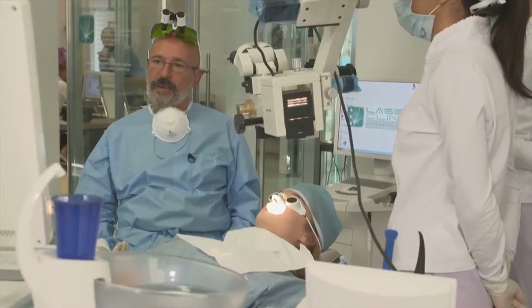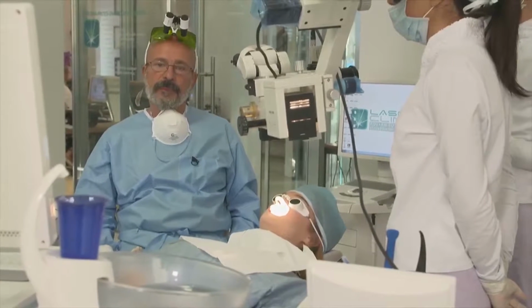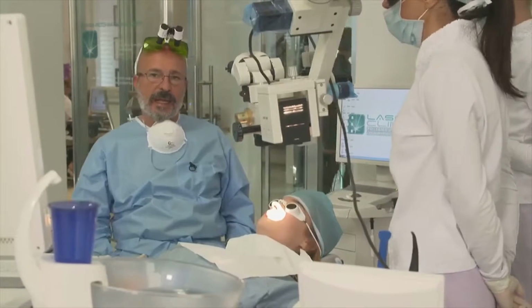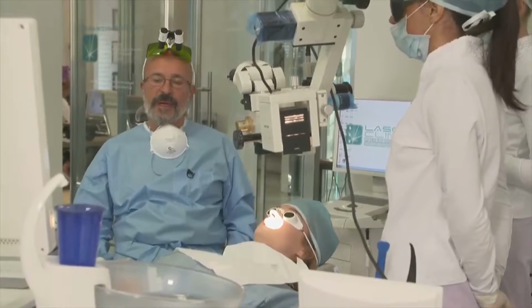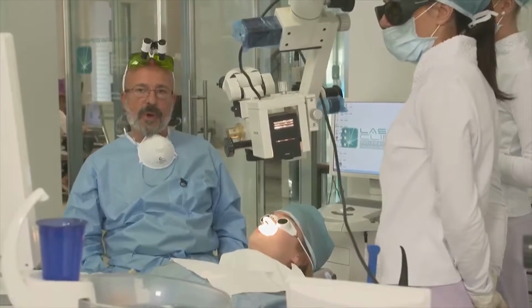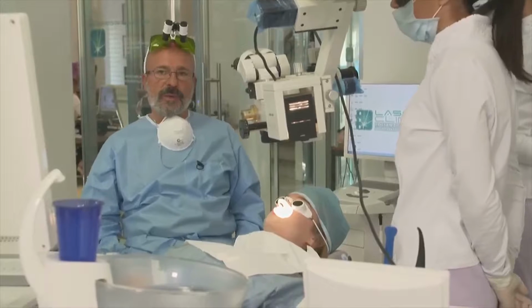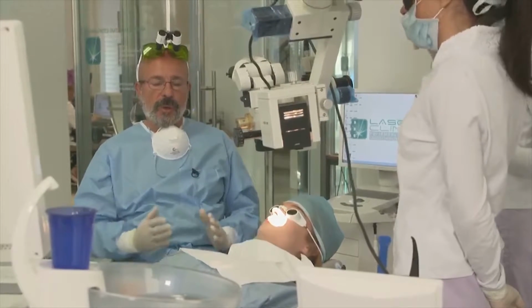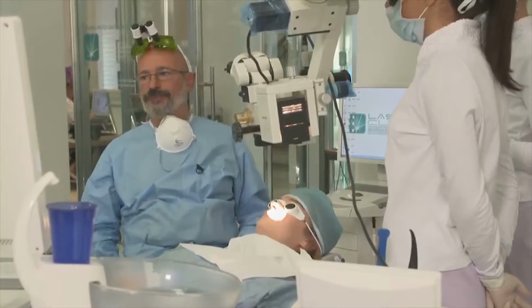As we heard from Professor Brown yesterday, we can use three wavelengths, and the 445 nanometer wavelength is more selective because it is only absorbed by hemoglobin and melanin, and the absorption in water is quite inexistent. No absorption in water at all. So we can use this selective action to control the bleeding at the end of the procedure.